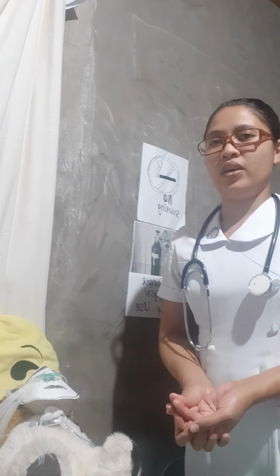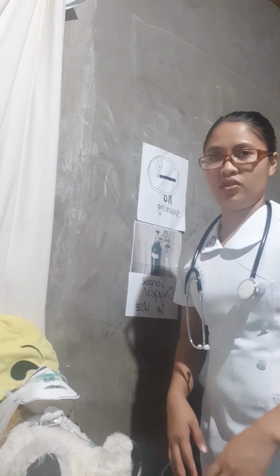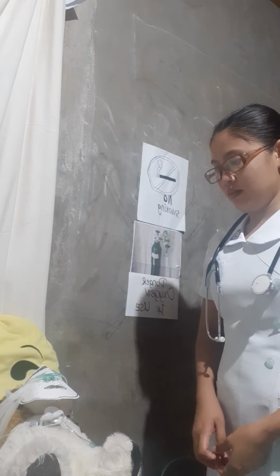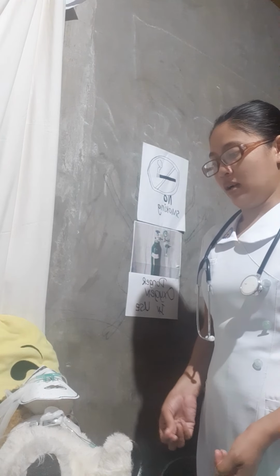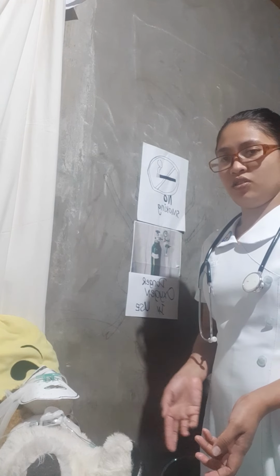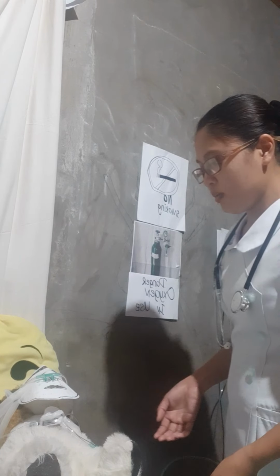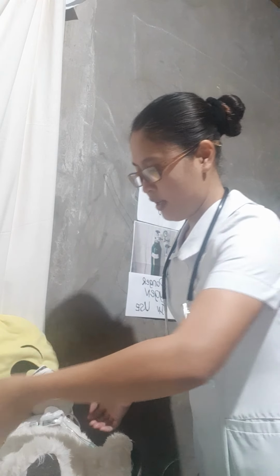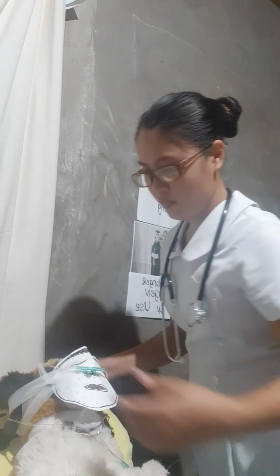Next, adjust the bed to a comfortable working position. Lower the side rails closer to me. If the patient is conscious, we need to assess him in semi-Fowler's position. And if the client is unconscious, remain in lateral position but facing me. So, excuse me, sir, I will position you in semi-Fowler's position. I hope you can cooperate. Thank you.